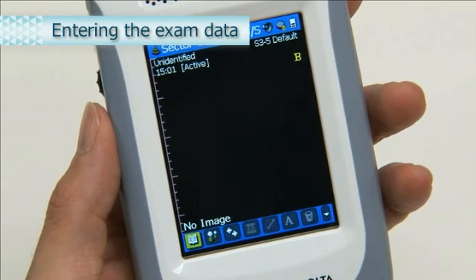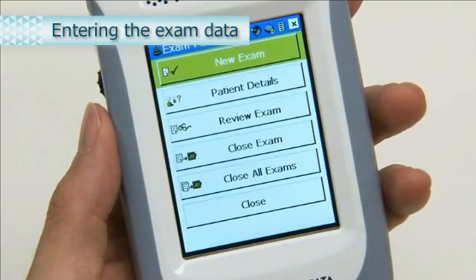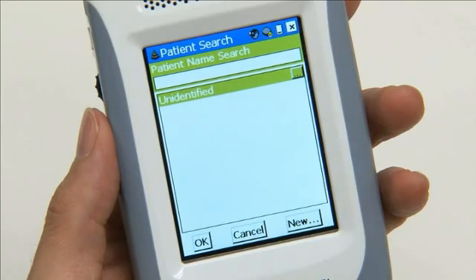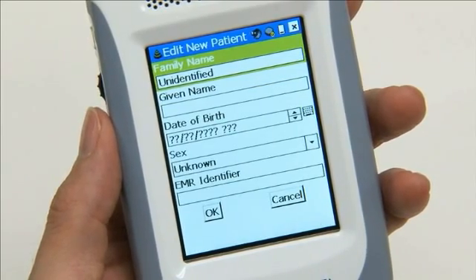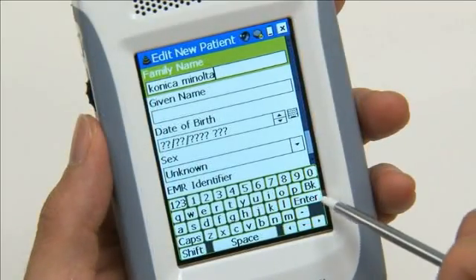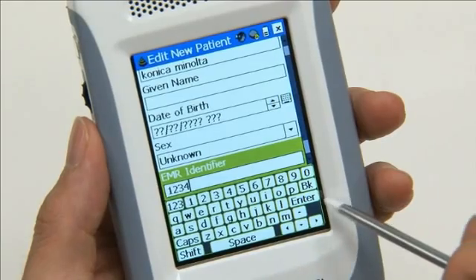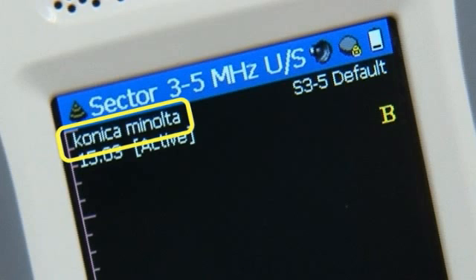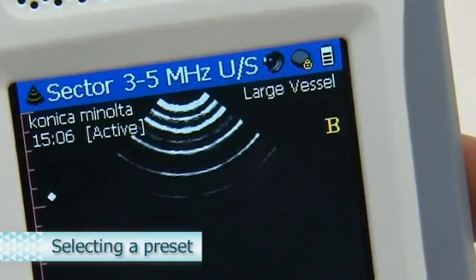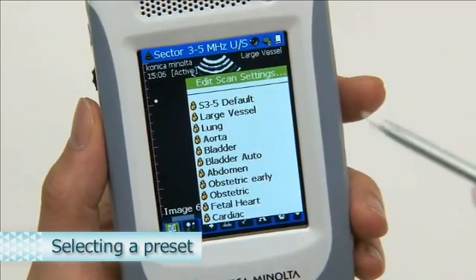First, enter the patient's name. On the toolbar, select the Exam Management icon, the second from the left. Select New Exam. The Patient Search screen appears. Select New at the lower right. The Patient Data Entry screen appears. Enter the patient's name, then enter the ID in the EMR Identifier column and select Enter to confirm. The name you entered is displayed. Next, select a preset by clicking the preset name displayed at the upper right on the screen. A list of presets appears; select the preset you wish to use.